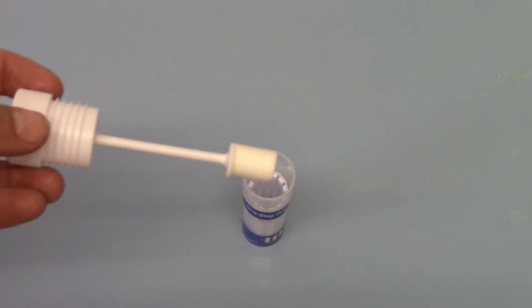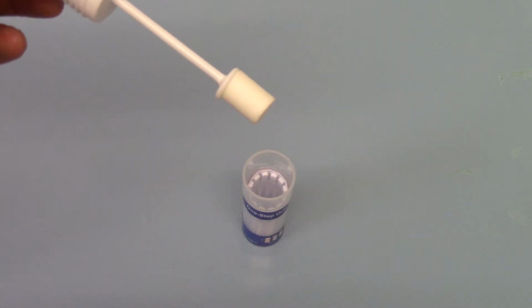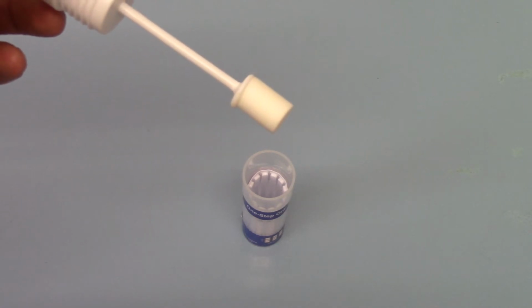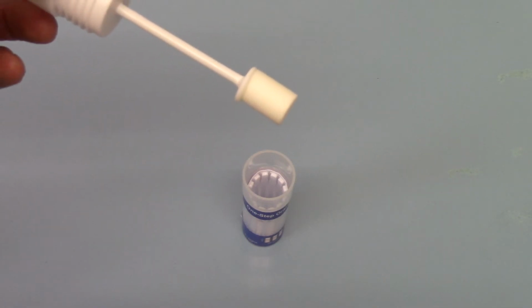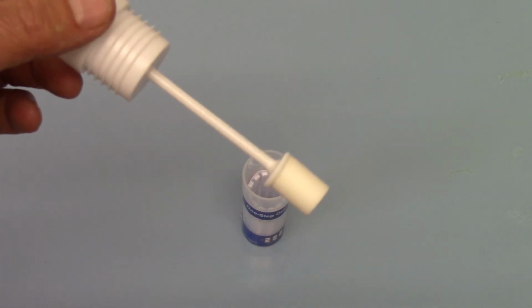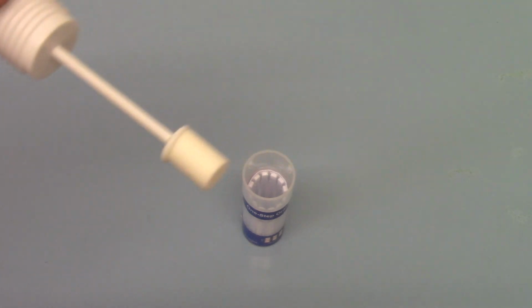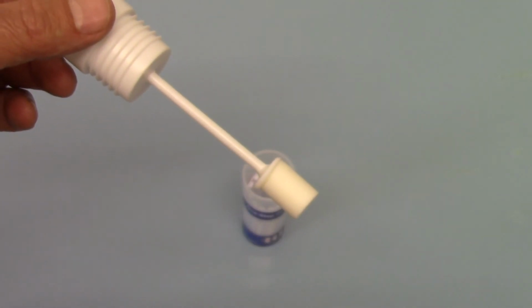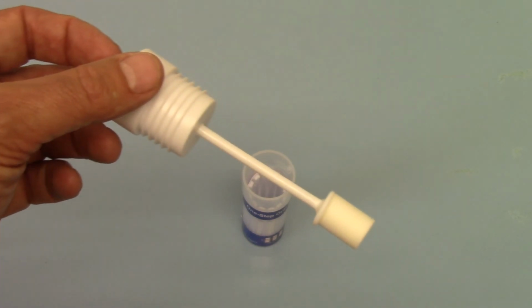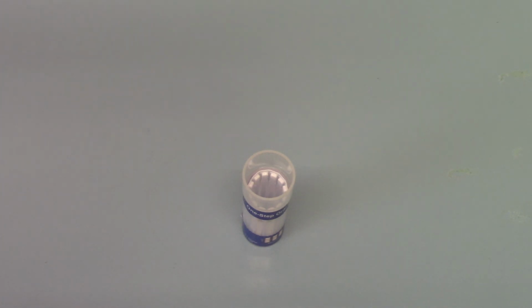If they really are not going to play ball with you, the other alternative is to ask them to produce a saliva sample into a clean cup and then saturate the saliva swab into that cup. You will not get as good a sample with that. You should, if that's going to be the case, still rub the dry swab on the inside of the top and bottom of the mouth to pick up drug residues before adding it into the collected saliva sample. So now what we're going to do is saturate that into saliva and show you the test being run.